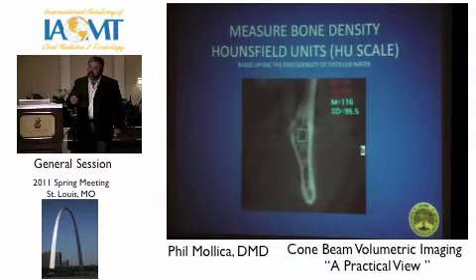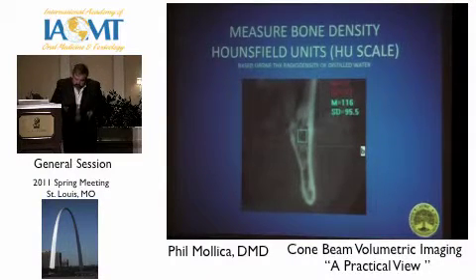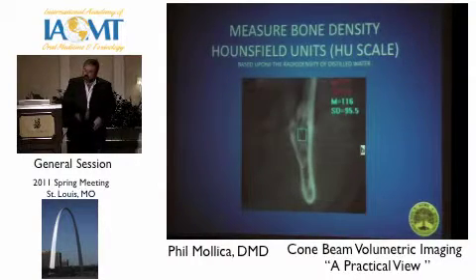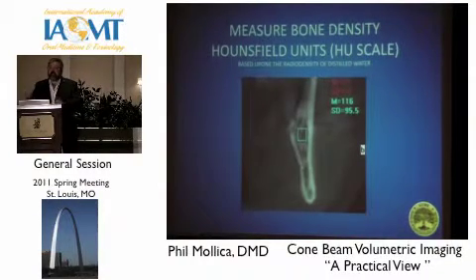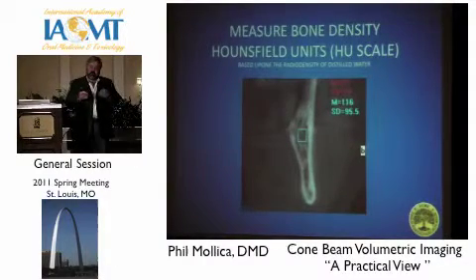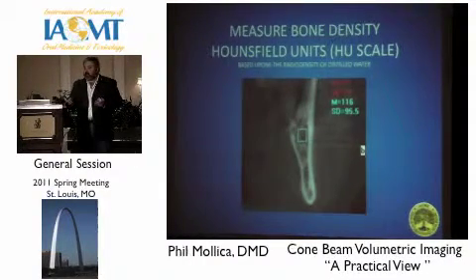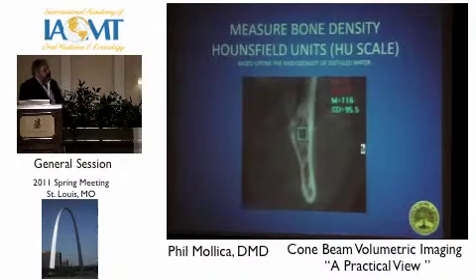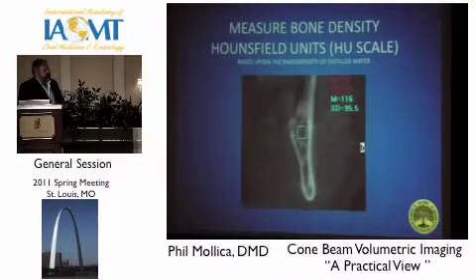So if we're treating these areas, at least we know we can measure objectively where we are at the beginning, during the treatment, and at the end. Are we doing anything? Are we seeing remineralization? Because in bone, if you see remineralization, you've arrested the infection. Pure physiology, pure biochemistry. So we have a way now that we can measure and visualize things.